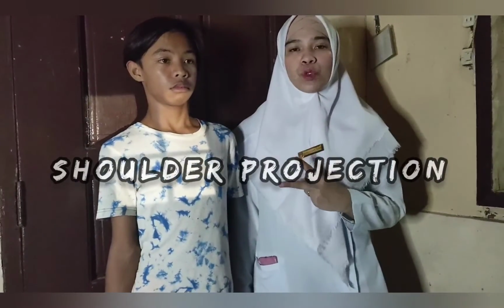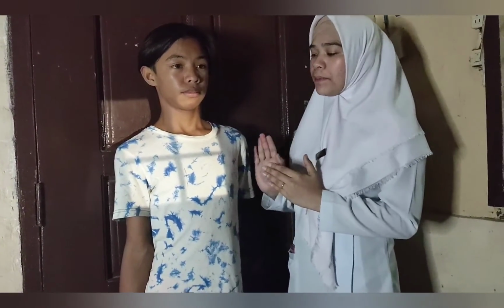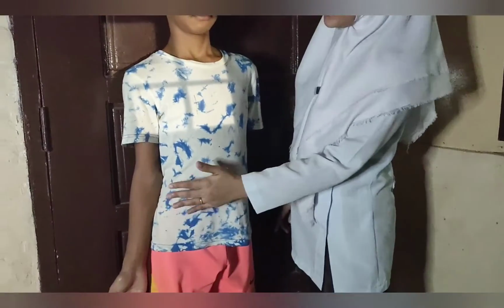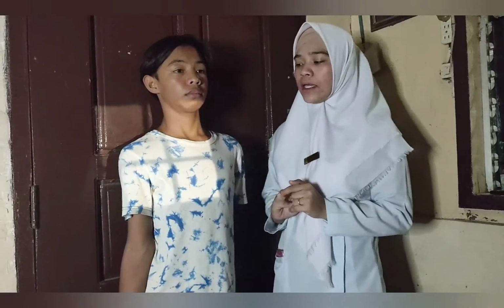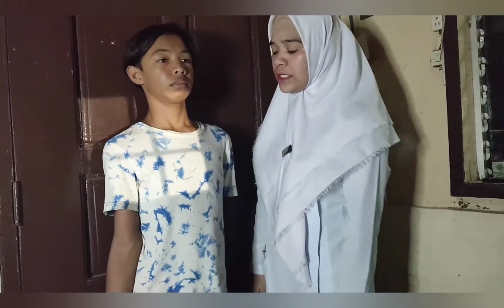Shoulder projection, we have two basic rotations, which are the AP projection external rotation and the AP projection internal rotation. So this one is the AP projection external rotation. Patient is in erect position. Usually this position is less painful for the patient. Part position, abduct arm slightly and externally rotate arm with hand supinated. CR perpendicular to IR, directed 1 inch inferior to the coracoid.